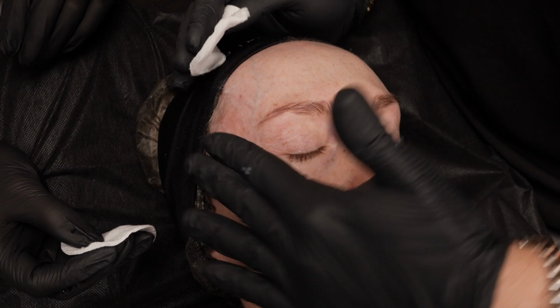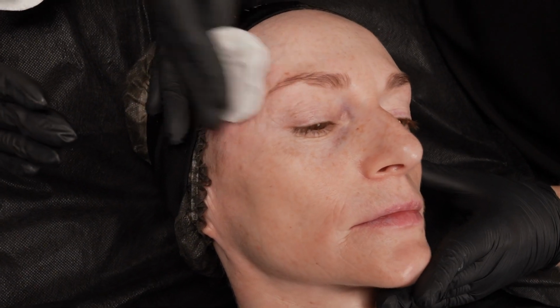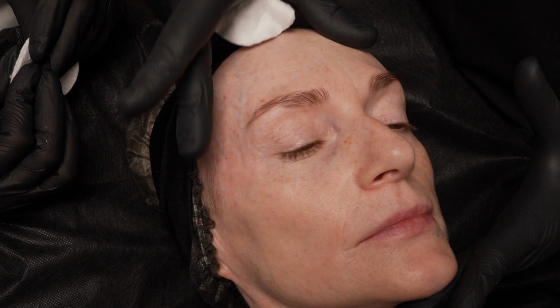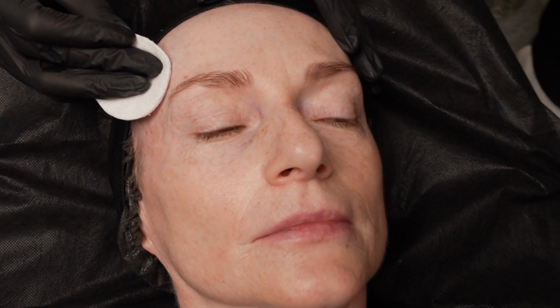Look, even 3, we don't have some irregularities. It's good. Yeah. Массаж? Yes, a little bit. Not so hard, like gentle. Nice. Good result. Thank you.